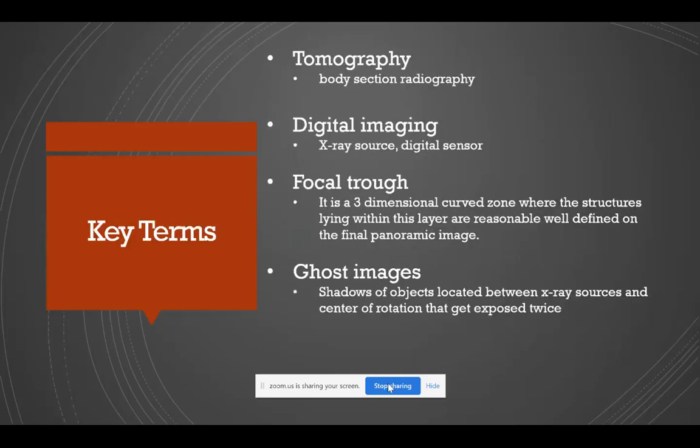Okay, so moving on to the key terms. Tomography, I would just be using this term briefly, which means body section radiology or radiography. Digital imaging, we know what that is already. If we do not, then instead of using films, we use sensors, and of course, there's an X-ray source.